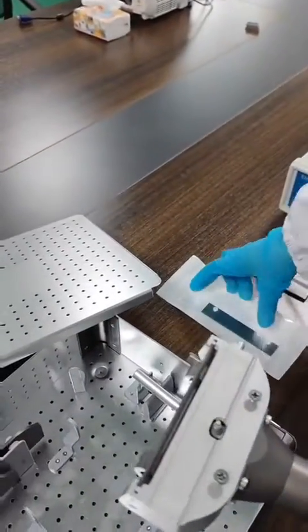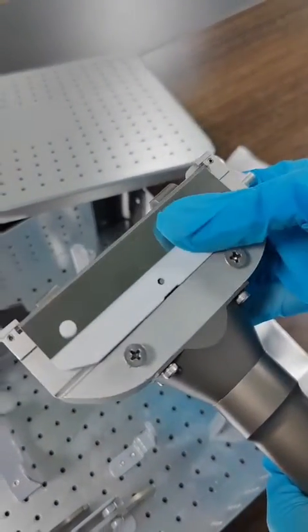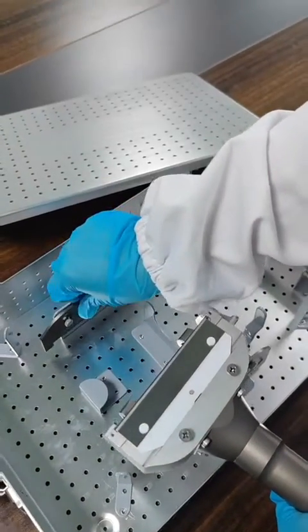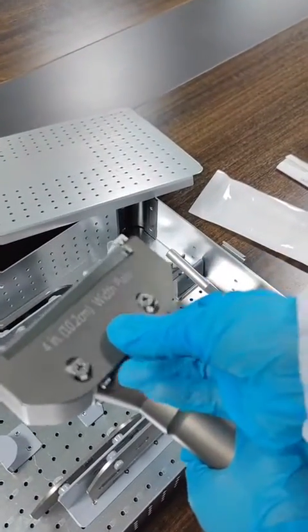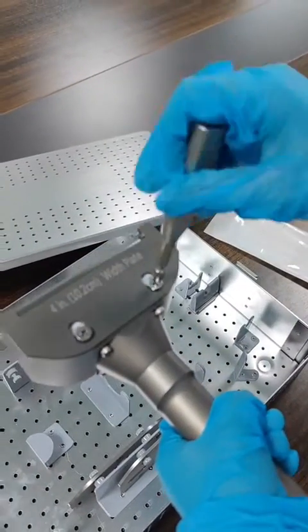Install the blades. Attention, please — the surface with the weld needs to be face up. Choose a width plate. Use the screwdriver to tighten the screws.